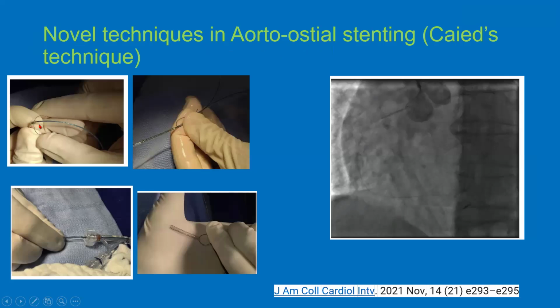You uncover the stent's proximal struts, and you make a loop of around 1.5 centimeters, like a J-tip, and then push it into the Y connector. So basically it looks like this when the stent is fully expanded. This is outside. Here we can see it forms a loop around the ostium, so it conforms to the plane, and this marks the ostium.